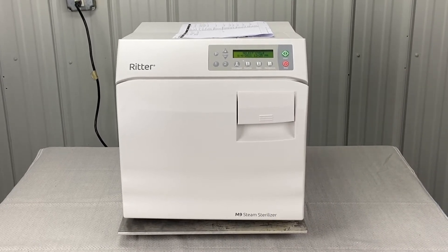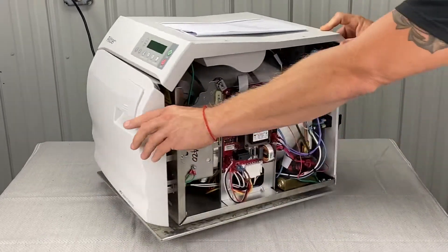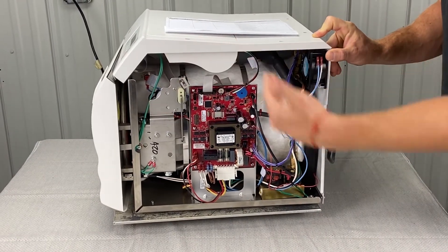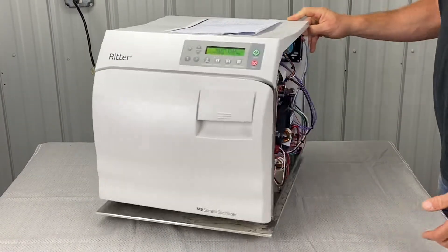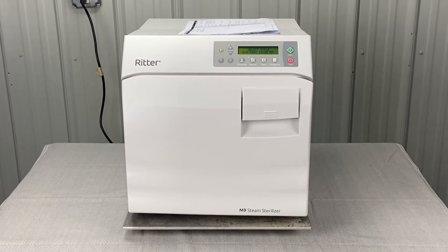The next thing is the sterilizer is not on level. That's pretty self-explanatory — make sure it's on a level surface. We don't want the front way higher than the back or vice versa, as that could cause it to get either too much water or not enough water.